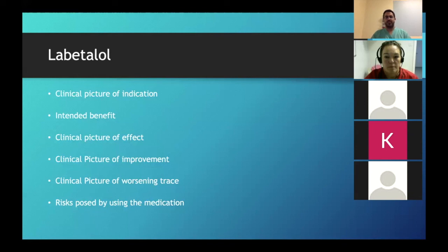And this baby is now just suddenly going to start showing that it's asleep. So variability is going to go off, and I'm going to think, well, maybe it's cycling. How do I figure out whether this baby is well, or is it just well and asleep, or is it just unwell now and it's lost variability because this baby is decompensating? Because in all situations, the baseline is going to stay the same.